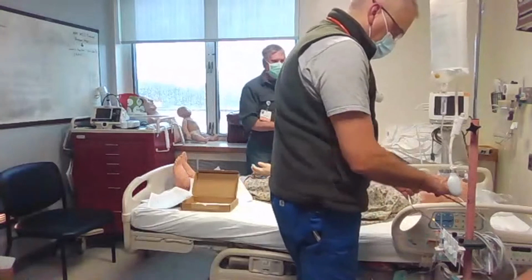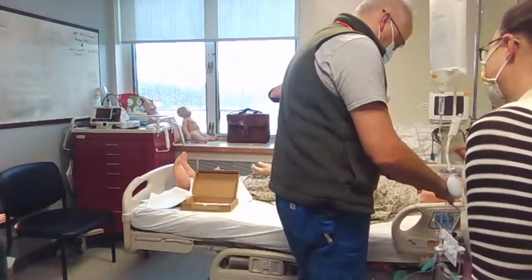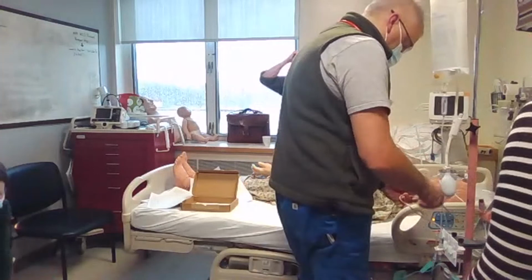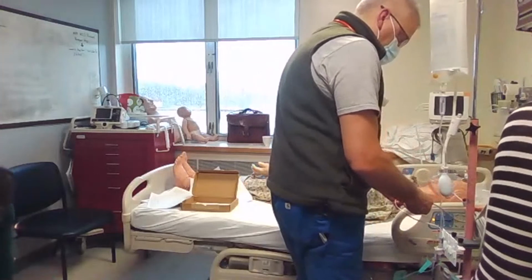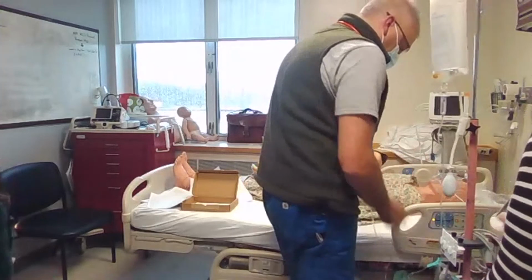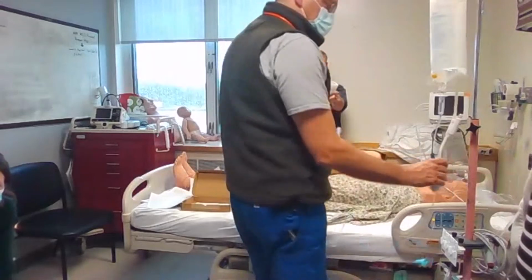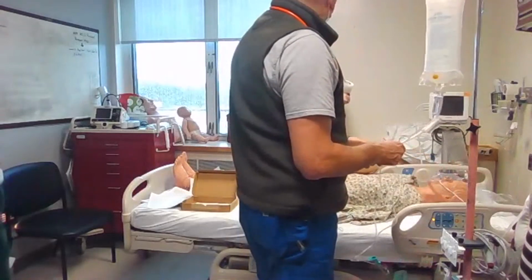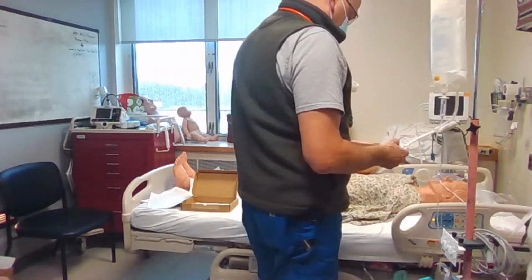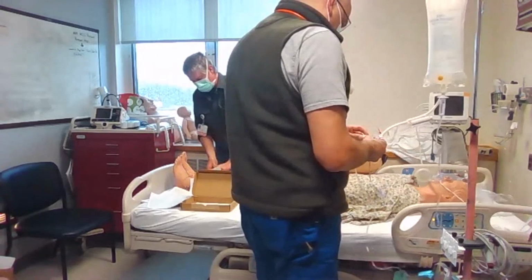So this little button pushes here on the hook. It's like a telephone jack. The pins have to line up with the monitor. That little button clicks it, and this is just like the end of your blood pressure cuff. I like the little flush doohickey. You won't be able to drain the fluid out of the line, but you can just go like this and walk through it, because the fluid will get stuck in there. These here would be the white ones if you want to change them out.